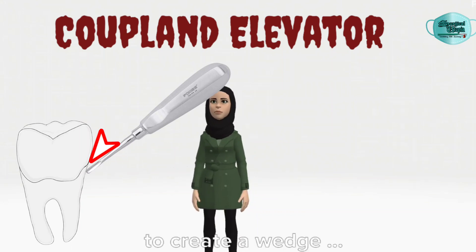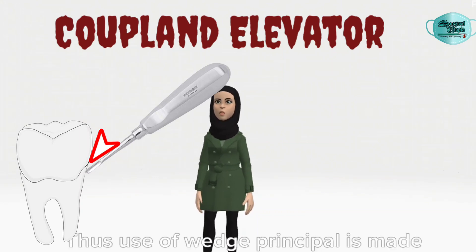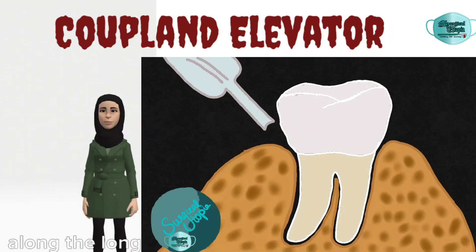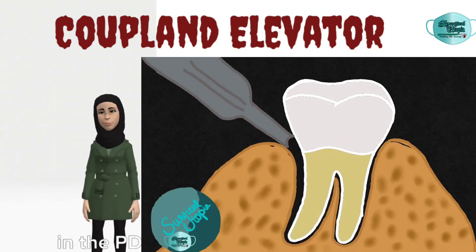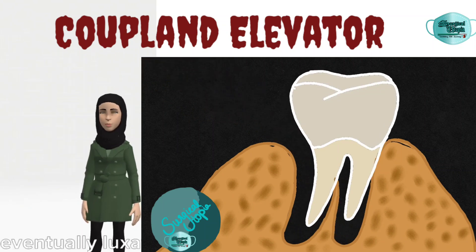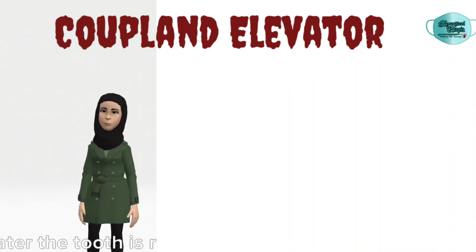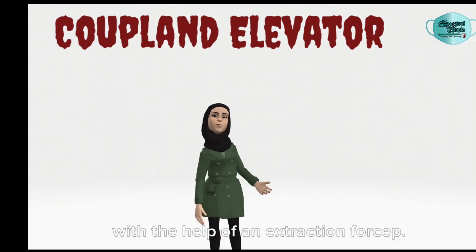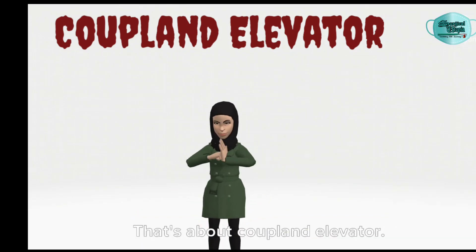The concave side of the blade is inserted into the periodontal space to create a wedge, thus making use of the wedge principle. Finally, the Copeland is applied along the long axis of the tooth in the PDL space to eventually luxate the tooth from the socket. The tooth is then removed out of the socket with the help of an extraction forcep.